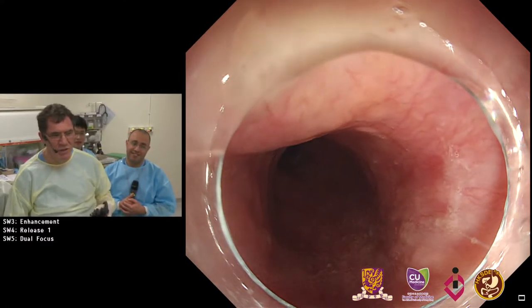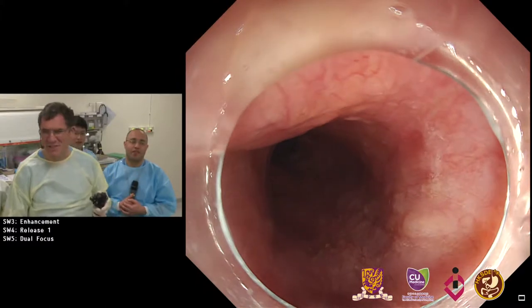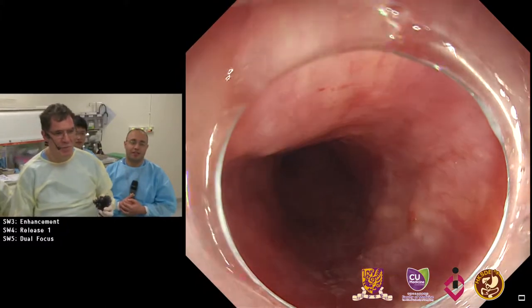This is really a huge diverticulum — I think this is the largest I've ever saw. We did quite a lot of these procedures.